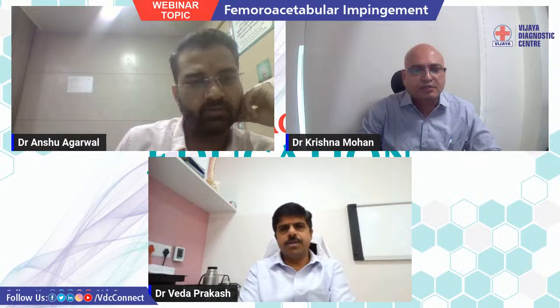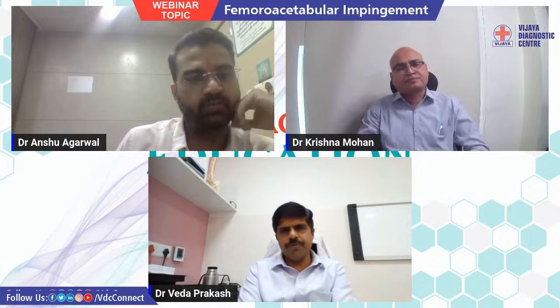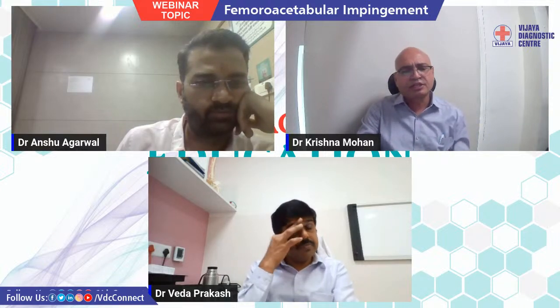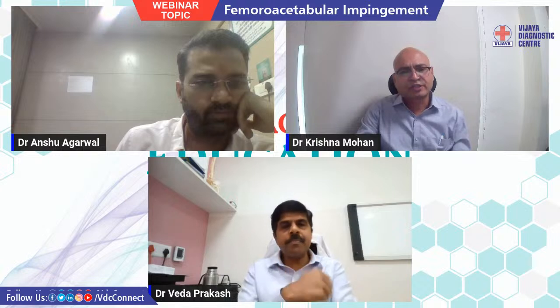Okay, got it. Small FOV. Yeah, small FOV images will usually be higher resolution.